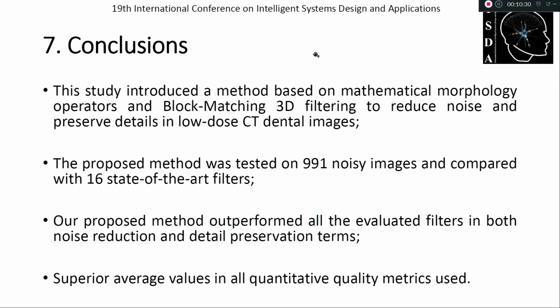So to summarize and conclude this presentation, this study introduced a method based on mathematical morphology operators and BM3D filtering technique in order to reduce noise and preserve details in low-dose computed tomography dental images. Our proposed method was tested on 991 noisy images and compared with 16 different state-of-the-art filters. Our proposed method outperformed all the evaluated filters in both noise reduction and detail preservation terms. Also, we obtained superior average values in all quantitative quality metrics used.